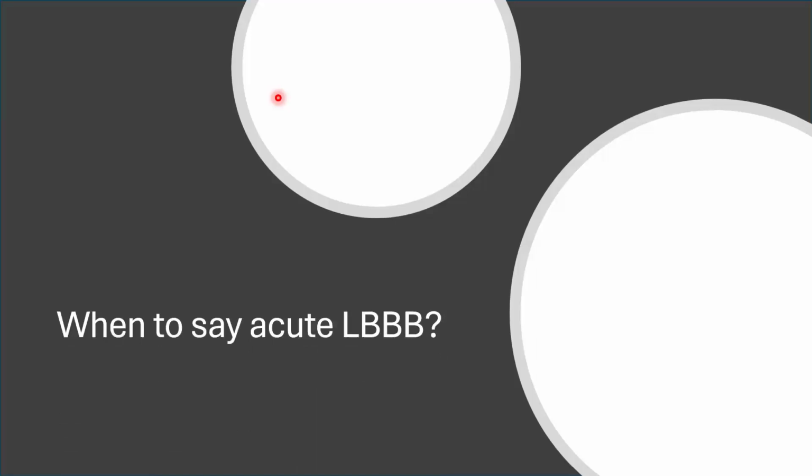The final thing that we're going to be discussing in the STEMI equivalent cases is the left bundle branch block. We will be discussing left bundle branch block later on in more detail, but what is important right now is diagnosing the acute or the new left bundle branch block, because it is, again, equivalent to STEMI, and the management of the acute left bundle branch block should be considered the same as the management of STEMI patients. But how do I know if this left bundle branch block is acute or new or not?